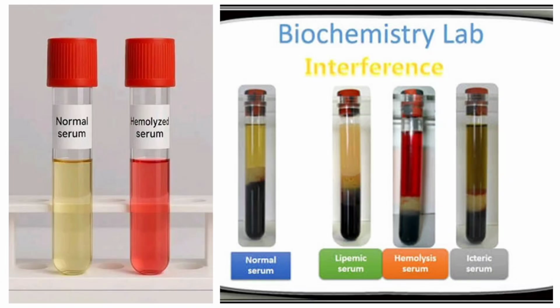Remember, in biochemistry especially, there's what we call a blank. If you want to adjust the reading, the sensitivity of the analyzer or the equipment you're using to measure, you use the blank. That means you can use distilled water, basically something neutral that has nothing of what you are trying to measure. You are zeroing it, bringing it to zero.